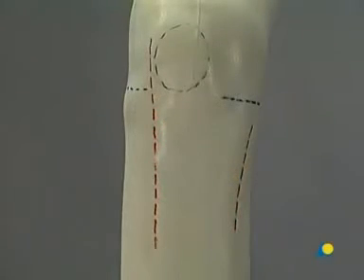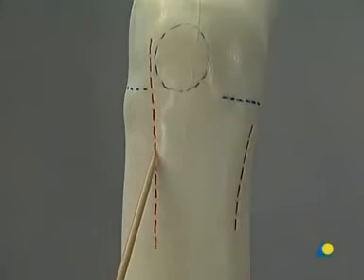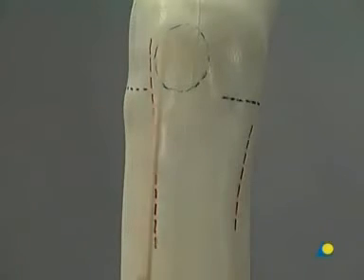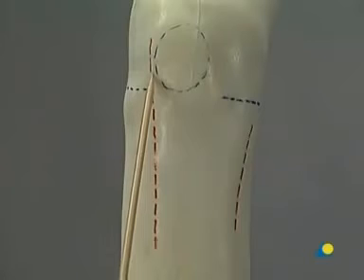To fix such complex injuries, 2 separate incisions are preferred, one posteromedially and one laterally, in order not to interfere with the delicate soft tissue cover over the tibial tuberosity. The patella and the lateral and medial joint lines serve as landmarks.